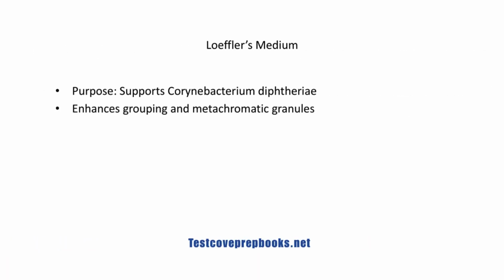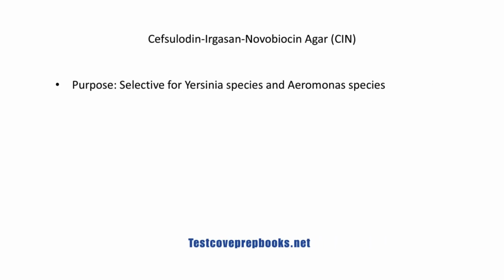Loeffler's medium is also used for Corynebacterium diphtheriae. It enhances the grouping of organisms and promotes the appearance of metachromatic granules, which help with identification. Finally, CIN agar, short for cefsulodin irgasan novobiocin agar, is selective for Yersinia species and Aeromonas species.